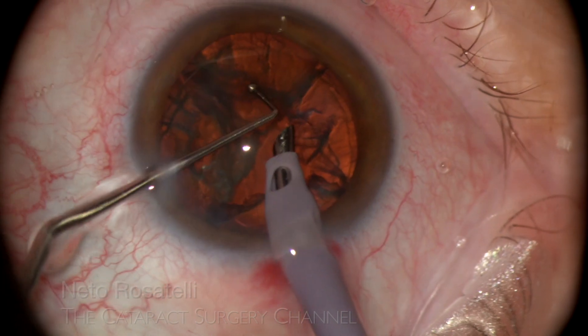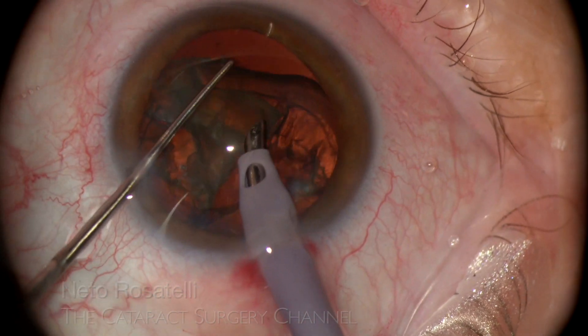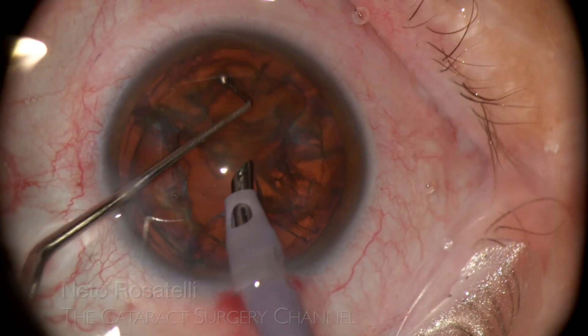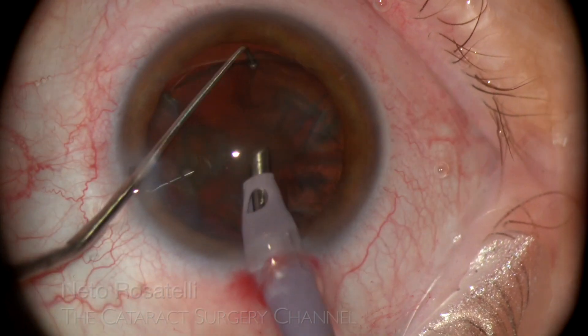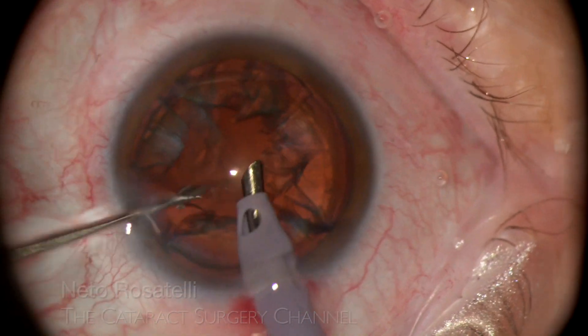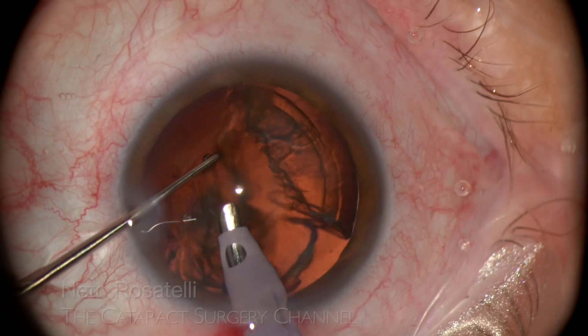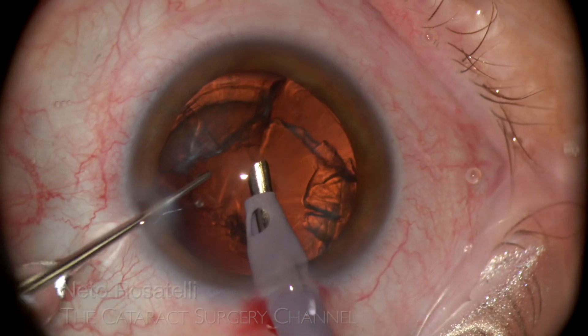Nucleus quadrant emulsification is done with very little ultrasound energy. The remaining epinucleus shell is easily aspirated with no ultrasound energy.